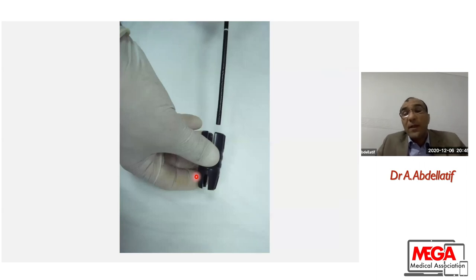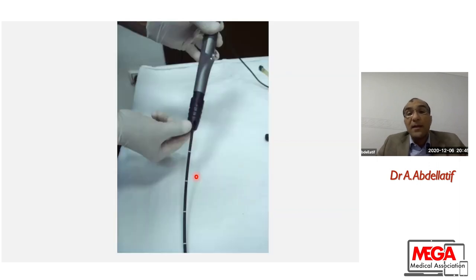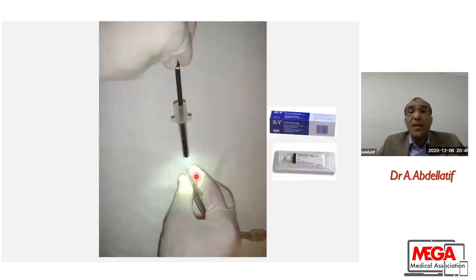Then I can use the tube holder if it is present. I have to put the tube holder inside the shaft and put it up like in the picture. Then I have to lubricate the shaft before loading my tube. Lubrication with KY gel or xylocaine gel is okay, but I have to avoid the lens when I'm putting the jelly. Maybe it will make blurring of vision when I go inside the patient.